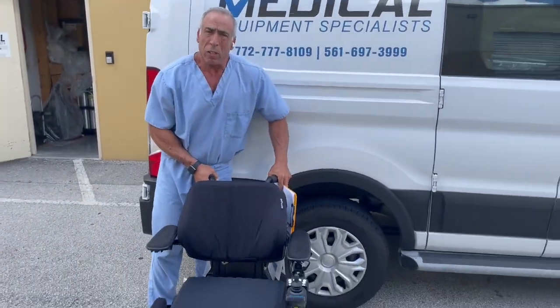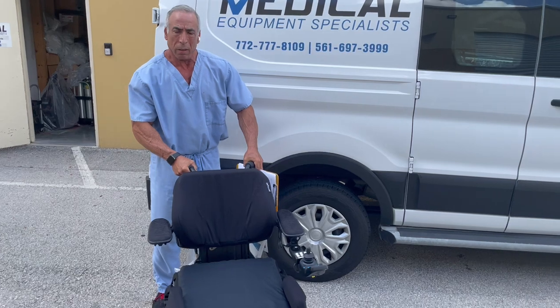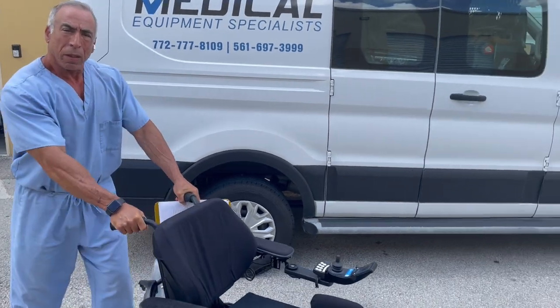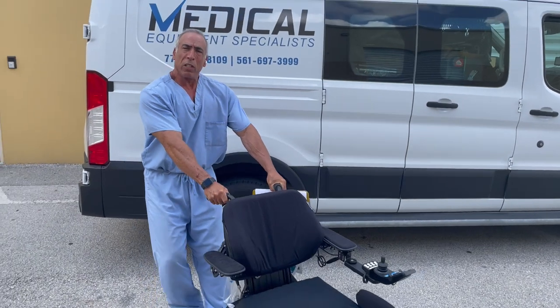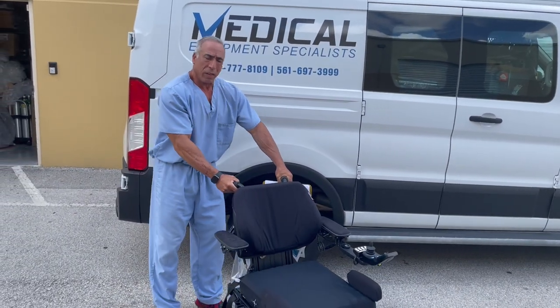In neutral, the motors are disengaged and the chair will push freely. It can be taken back to the home, where Medical Equipment Specialists or your service provider can be called to find out and take care of it.